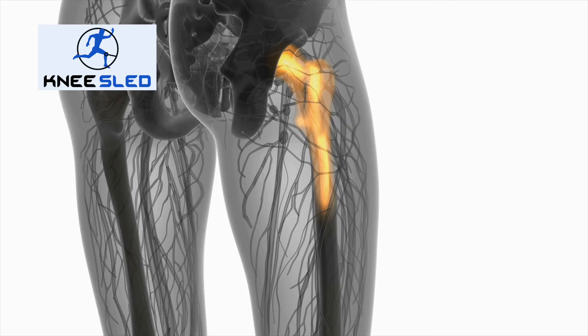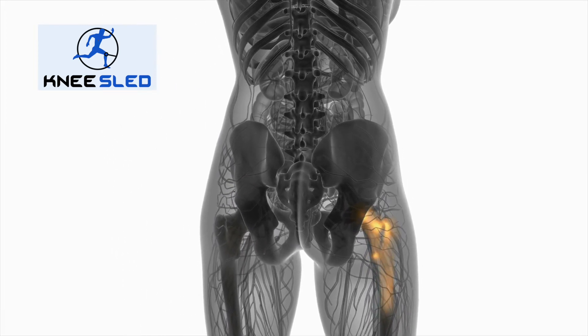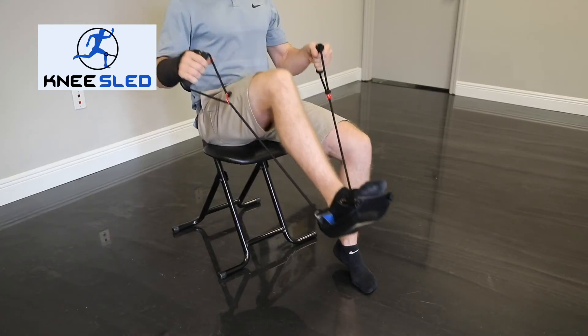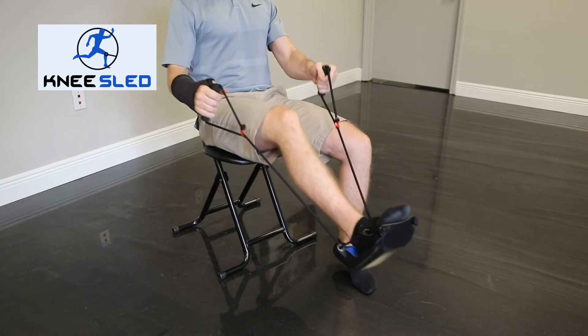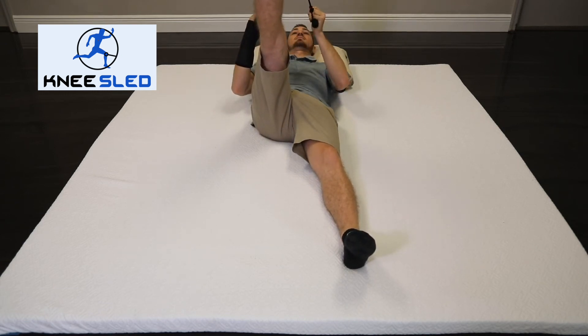The goal is to increase your range of motion every day. For example, you can perform hamstring stretches by keeping the knee straight as possible and pulling up and back on the rope. You can perform glute stretches by bending the knee and pulling straight back.